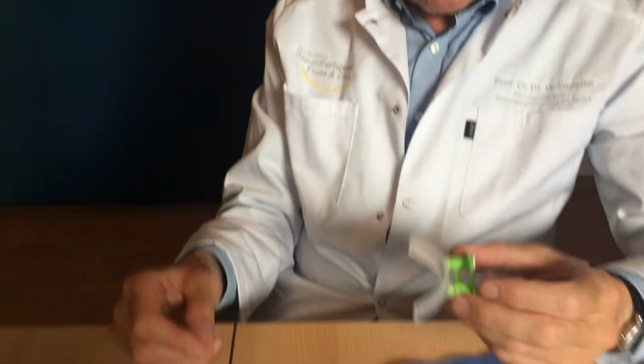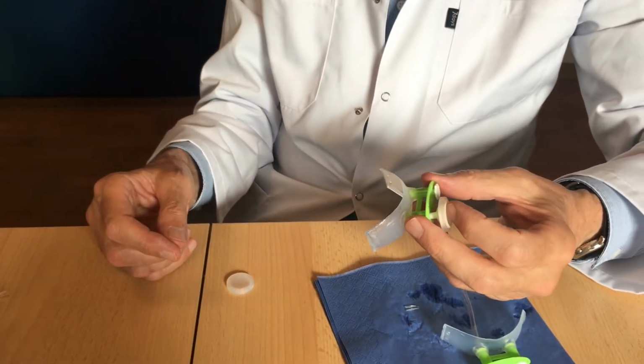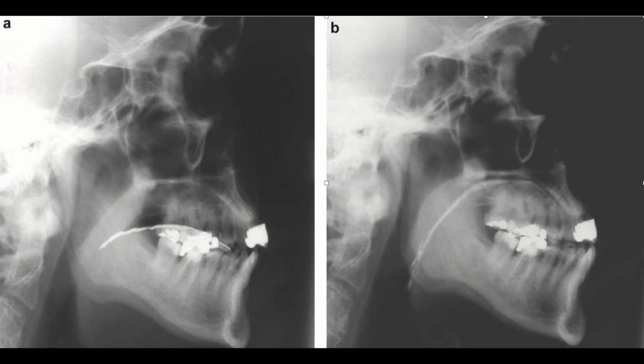And we can now use an endoscope to check if the tongue is in a correct position. This can be also done with radiography. We did a study using the vacuum activator when taking radiographs.